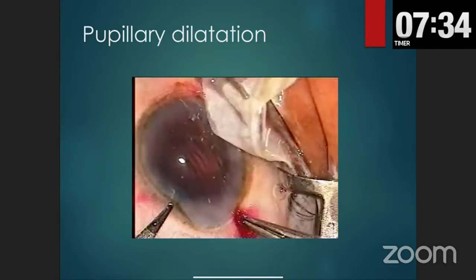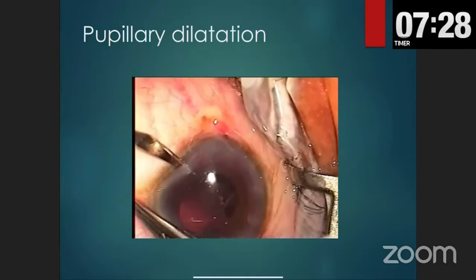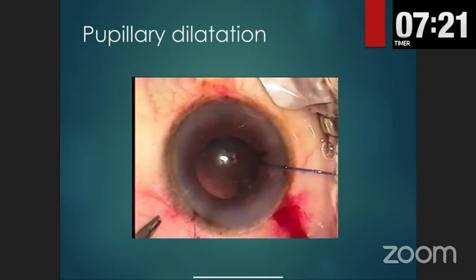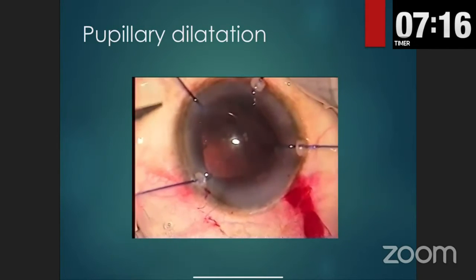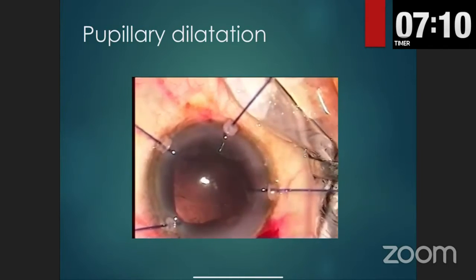One other thing is that most often when we are having a PCR, when the surgical time is higher or when it's a pseudoexfoliation patient with a PCR, there is the problem of a small pupil. Whenever we have a small pupil when doing an extracapsular cataract extraction or a manual small incision, it doesn't matter because you're at the end of surgery. Never hesitate to place iris hooks.